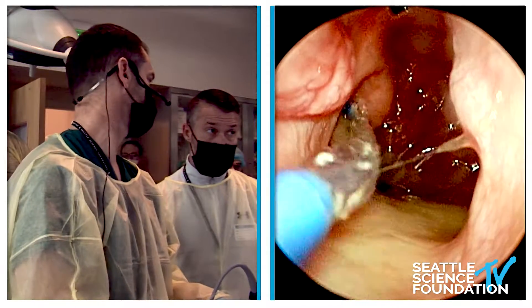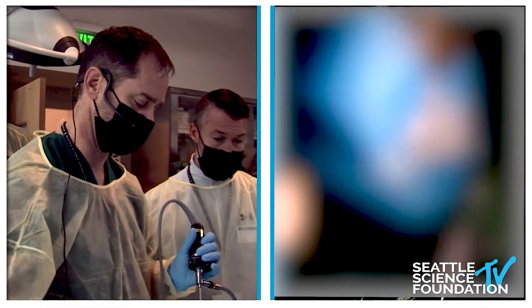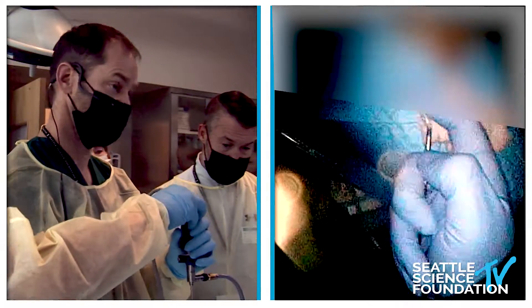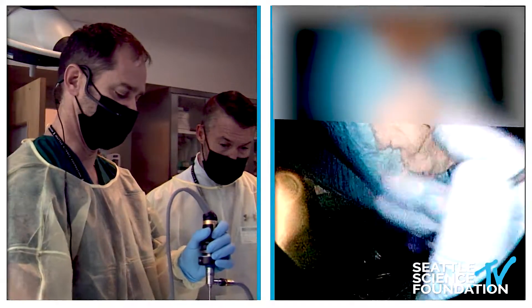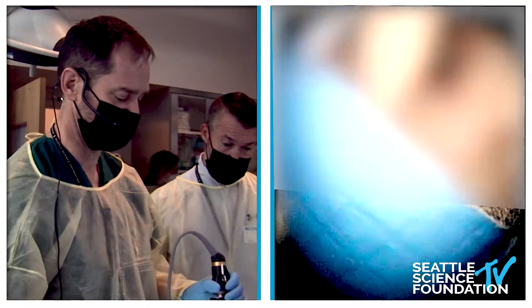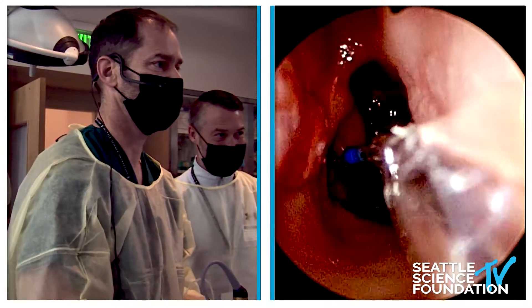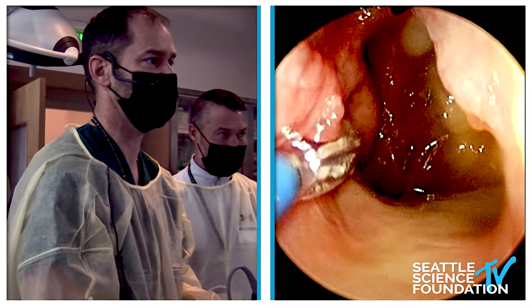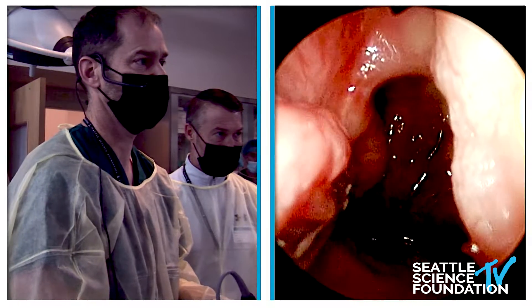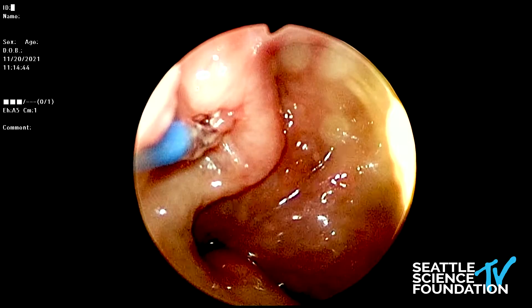Does it advance? No, but it is malleable. This is the malleable one that allows you to bend it by hand, and it gives a pretty nice angle. We'll see how it goes. It's always fun to try something for the first time on international TV. Pretty straightforward — different from the other ones you're used to. There's no guide wire, and it just falls in when you're in the right path.